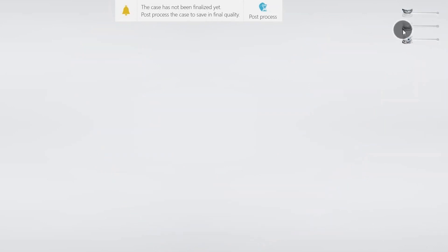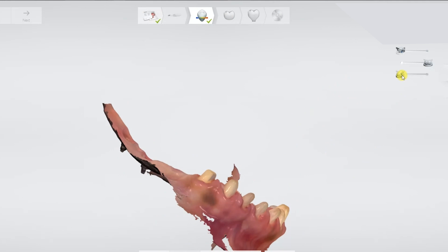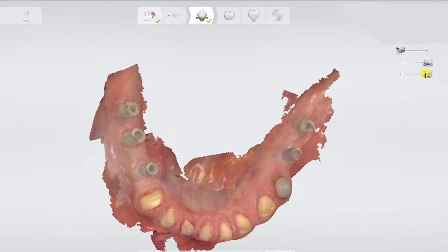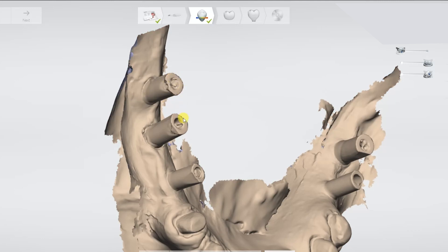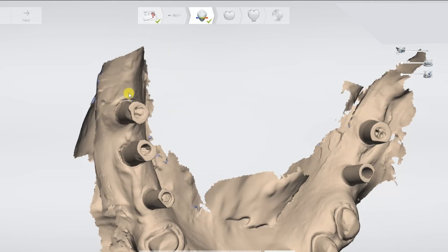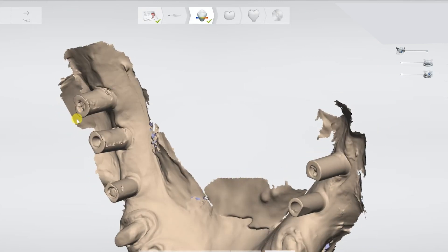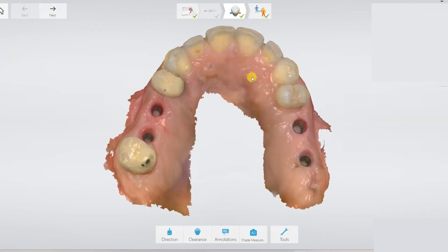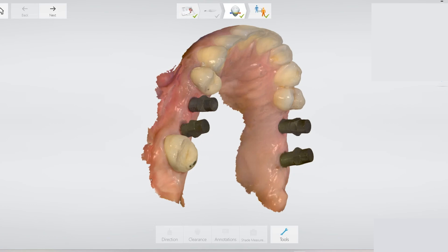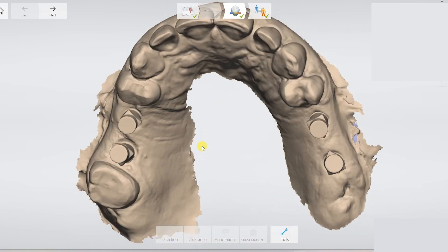Without a good scan of the coronal area, you will not get an accurate passively fitting implant prosthesis. As you can see in this case, there is a lot of distortion on the aligning surfaces of the scan body, which makes this scan absolutely useless for the lab. This other case, on the other hand, has good definition on the aligning surfaces and is perfectly good to send to the lab.